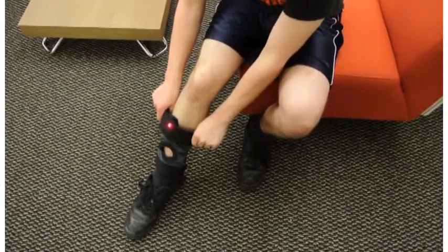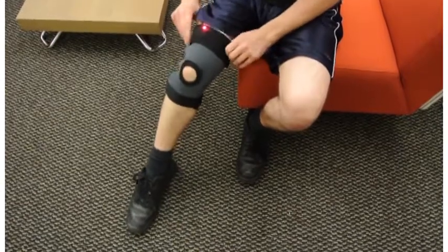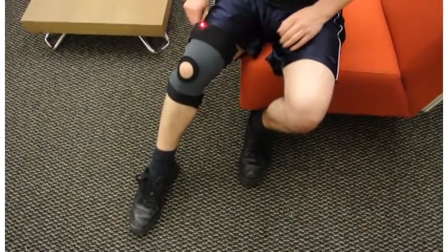The Knee Natural Exercise Evaluator, also known as the Knee, is an instrumented knee brace that passively captures all the gestures of a recovering patient during the day.